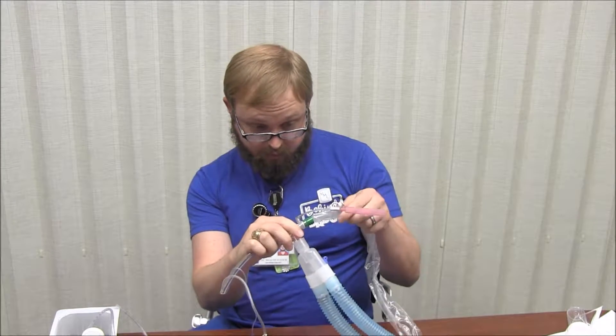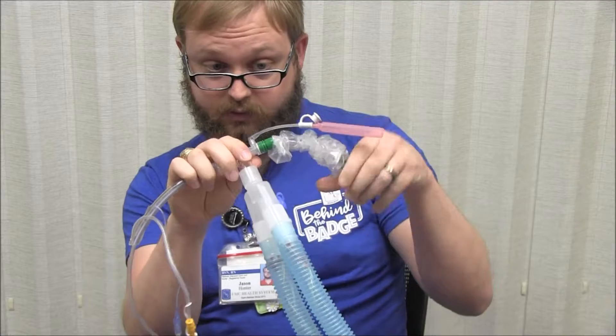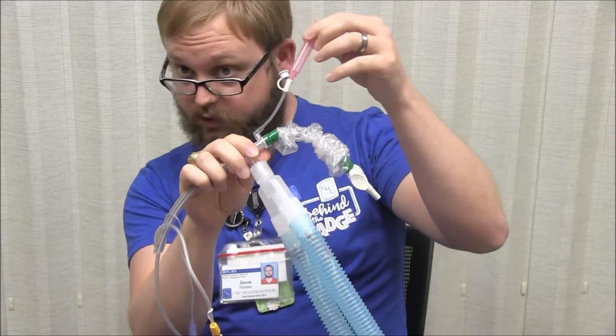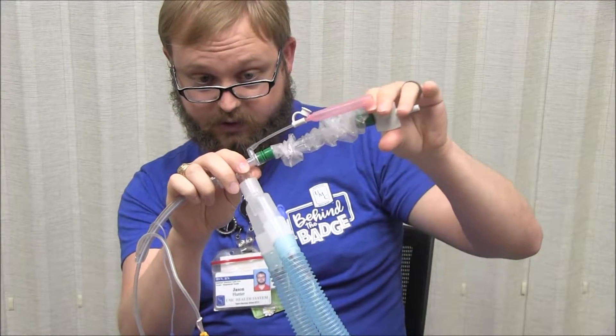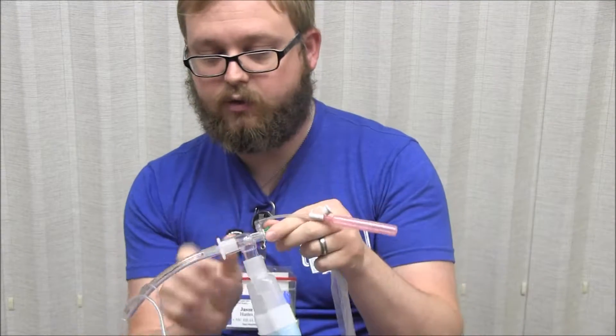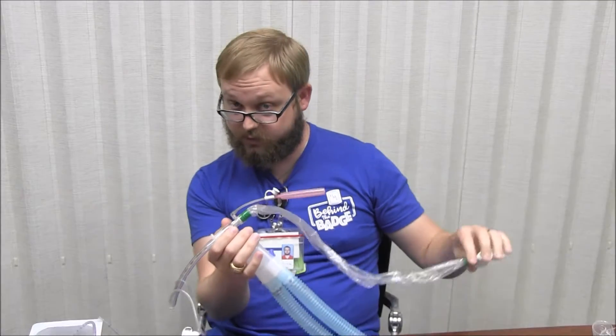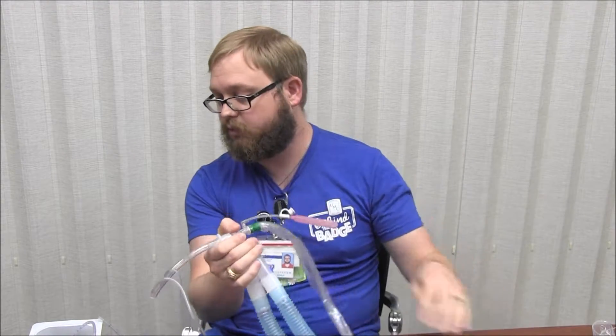If you are going to suction your patient down the ET tube, we want you to advance the inline catheter first, then get your sample, and then suction all the way back out — that should take less than 10 seconds. The reason you want to advance the inline suction first is that if you apply the saline first, the patient will start to cough, gag, and bite down, and you won't be able to advance the tube.